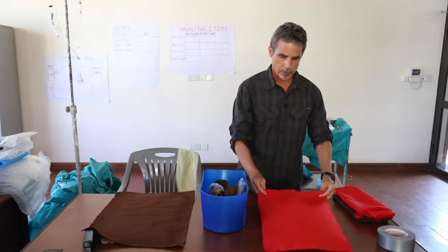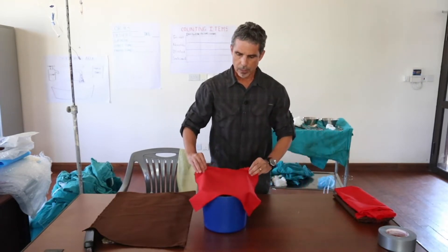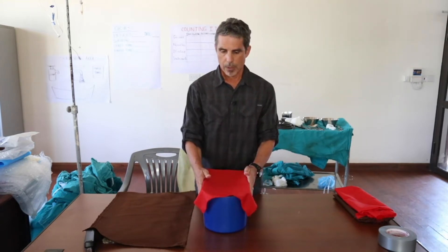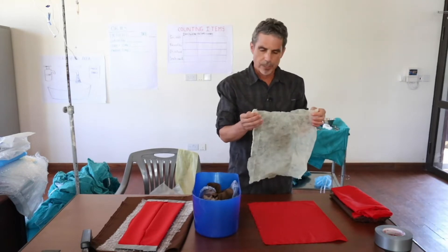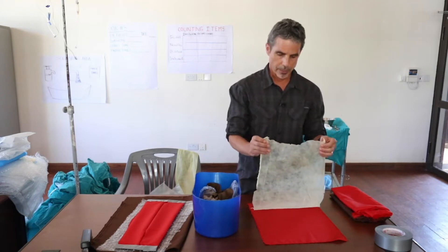The uterine layer is just a simple fabric. It's important that all the pieces are about the same size — the fabric should fit over the bucket. The next layer is the peritoneum. You can use either cling wrap, cellophane, or anything that's really thin and easy to go through, as peritoneum is.